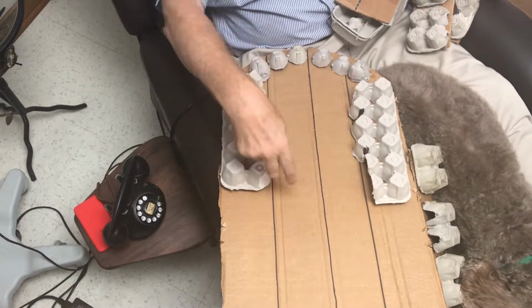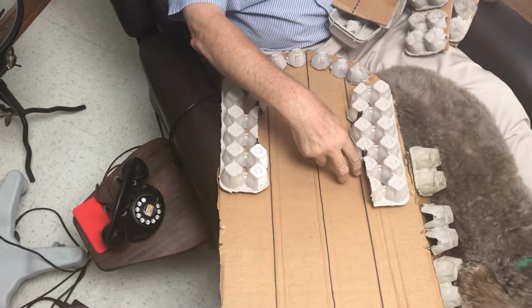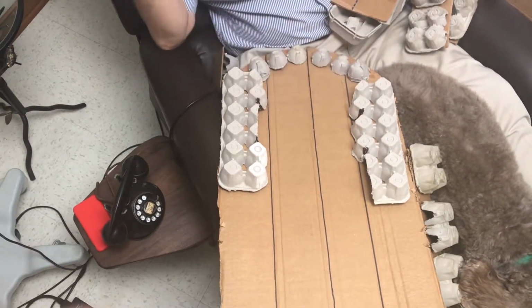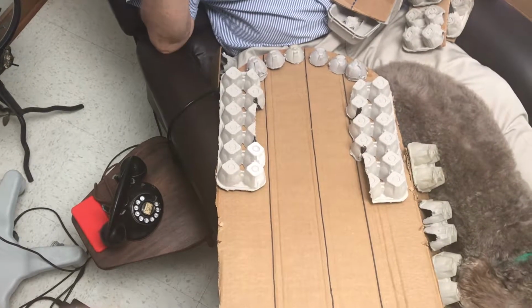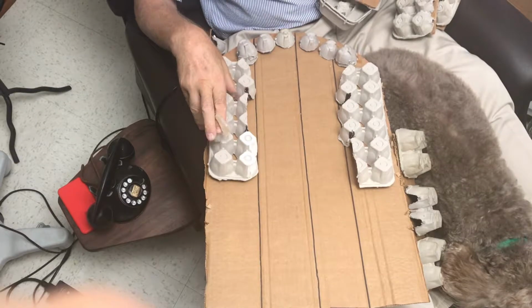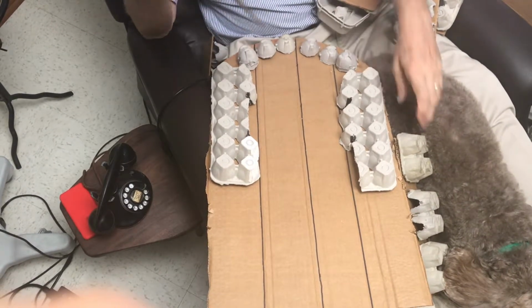As it hits this, it bounces on that side, hits this, and then hits that, and comes up through that groove. We'll go over it in detail over and over again, but the point is that the appliance has to be contoured.